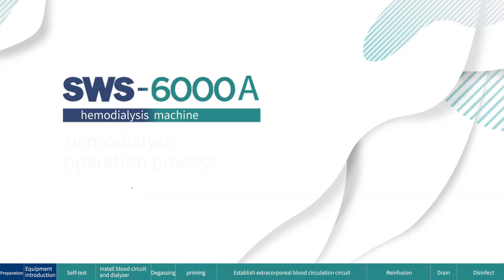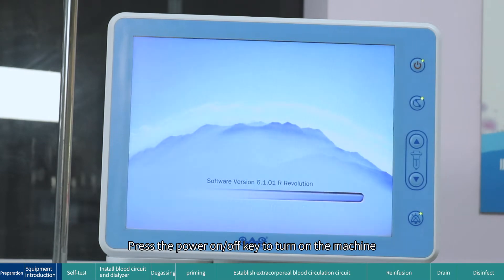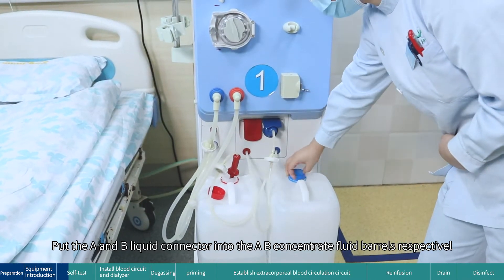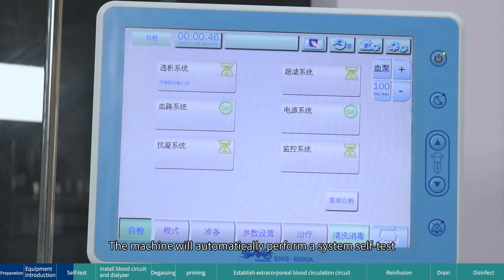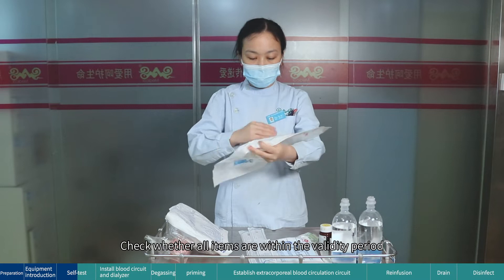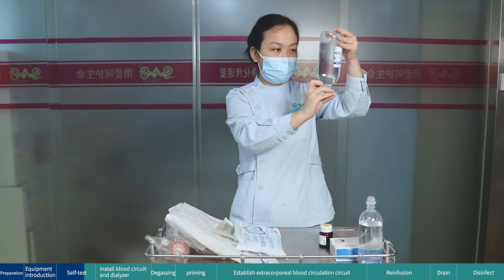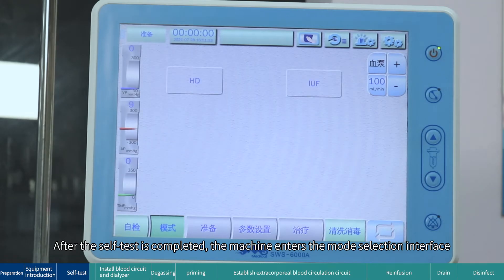Bubble catcher arterial steps — self-test: press the power on/off key to turn on the machine. Put the A and B liquid connectors into the A/B concentrate fluid barrels respectively. The machine will automatically perform a system self-test. Check whether all items are within the validity period, whether the packaging is complete, and whether the liquid is turbid. After the self-test is completed, the machine enters the mode selection interface.